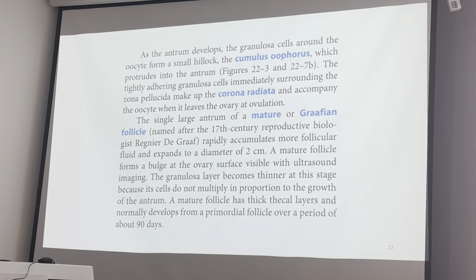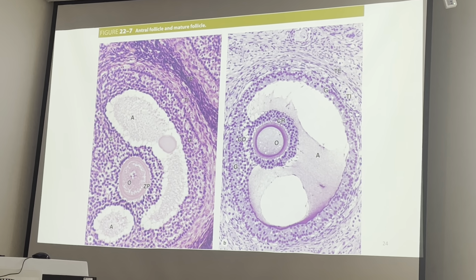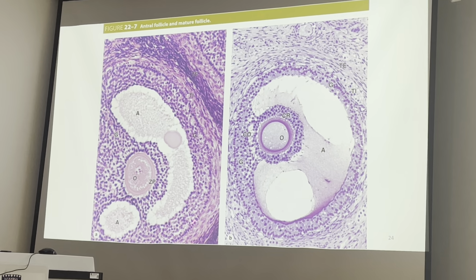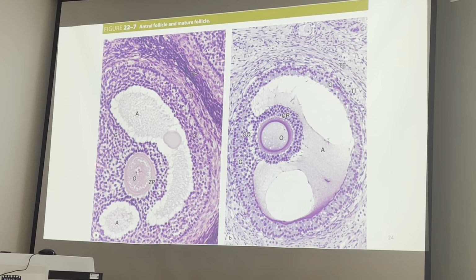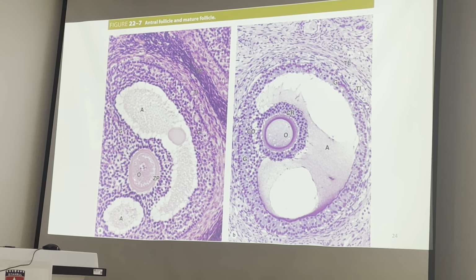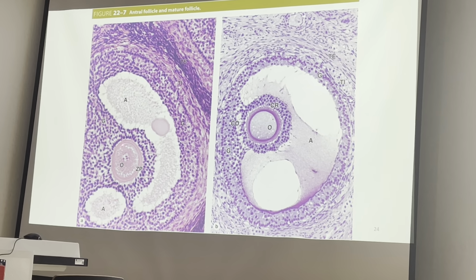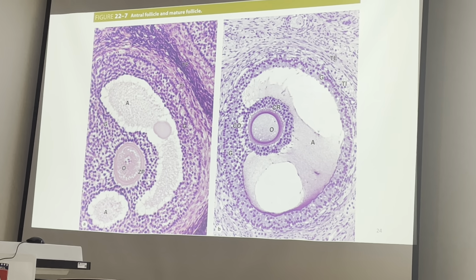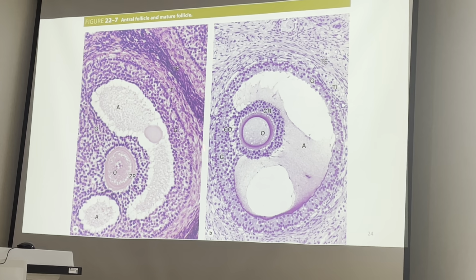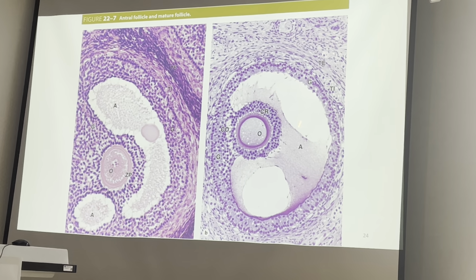We talked about the theca interna and theca externa and also the Graafian follicle in our yesterday lecture. What is the name of this follicle? Secondary follicle. You can see antrum and oocyte in this part. What is the name of this oocyte? Primary or secondary oocyte? Primary oocyte. What is the name of this follicle? Again, secondary follicle with major antral structure.